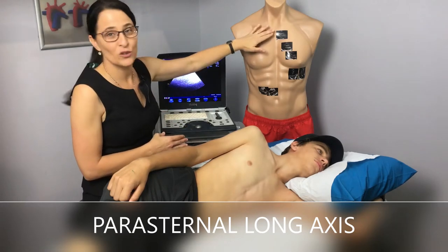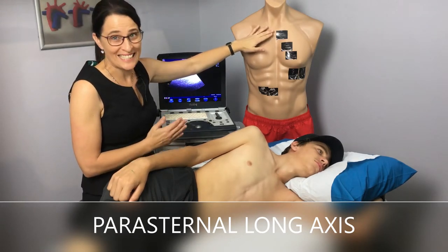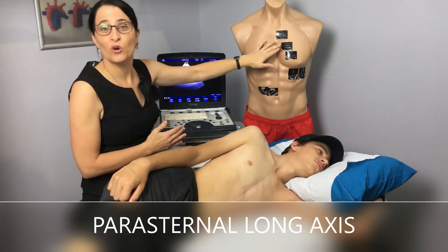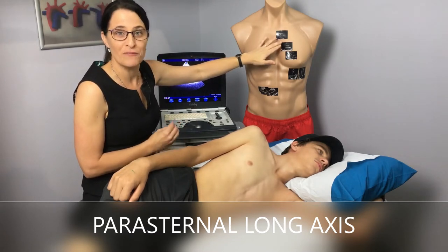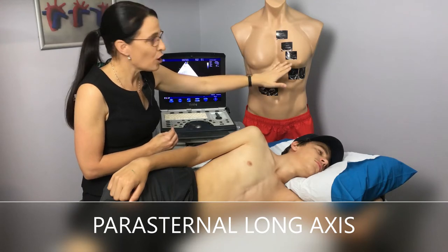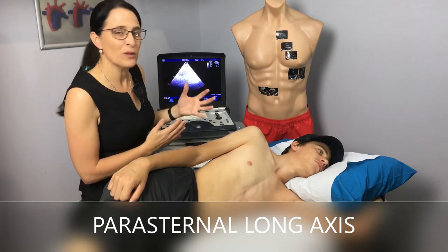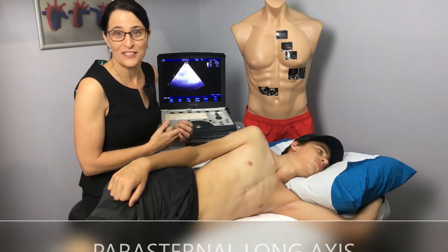A high parasternal window, great for assessing the ascending aorta. A lower — what we would call the ideal parasternal window — which is great for measurements. And a lower parasternal window which is a complementary view of the ventricles and the valves.